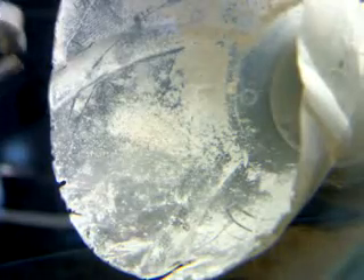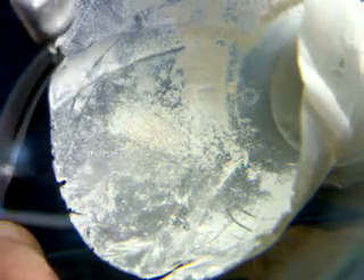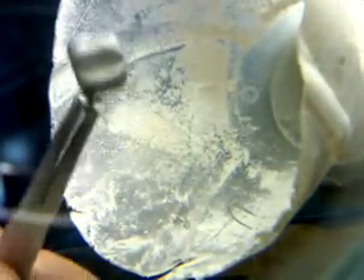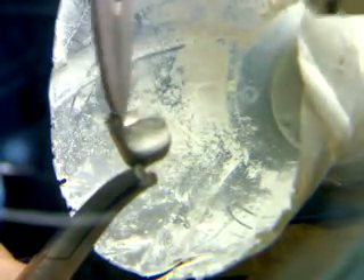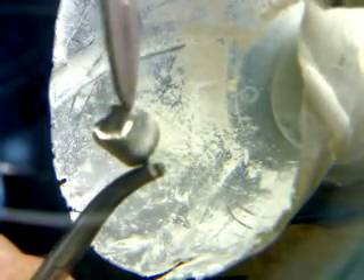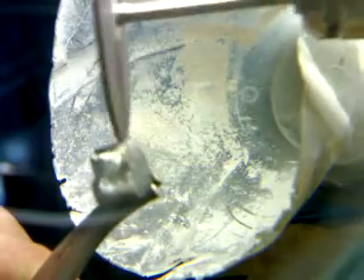At this point I can start grinding with my disc. I turn on my suction and I start taking off all the oxide surface from the casting. You can see how the surface gets ground. And this is done all over the surface of the coping.